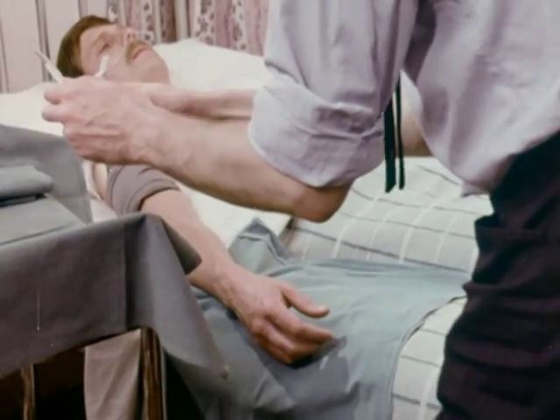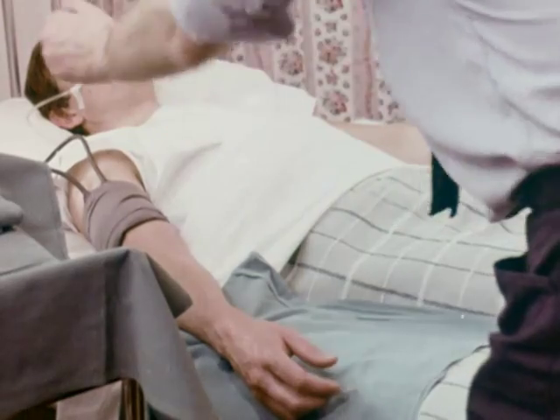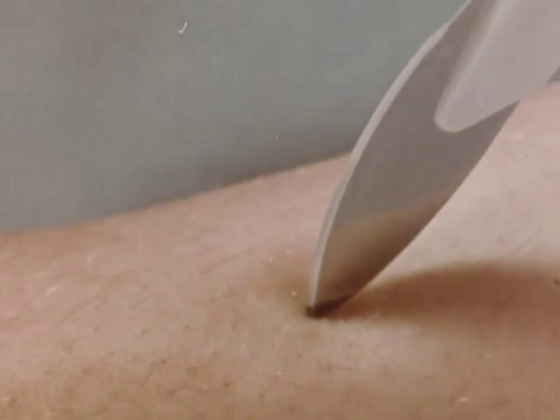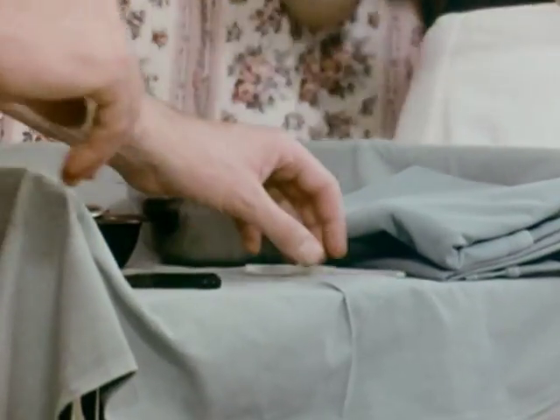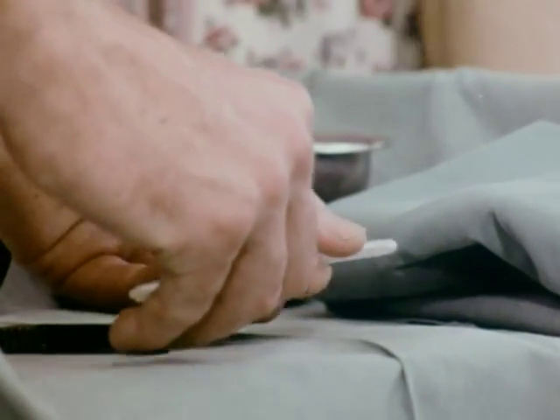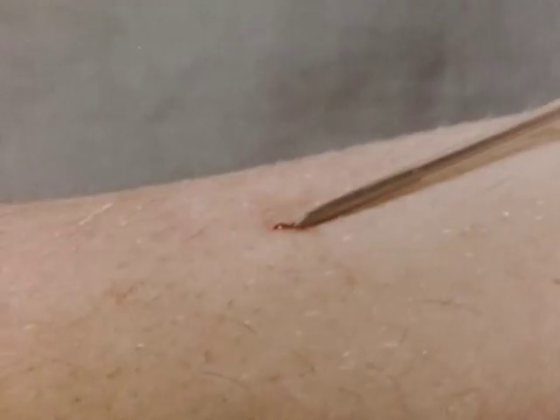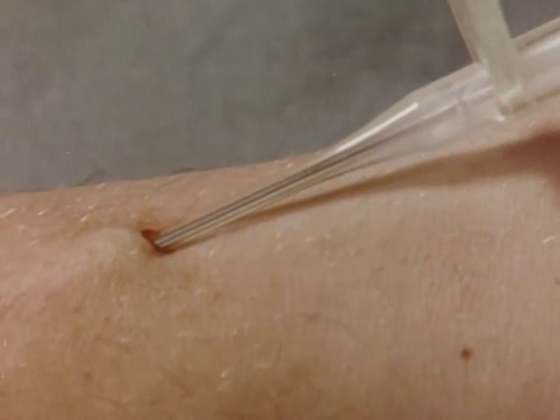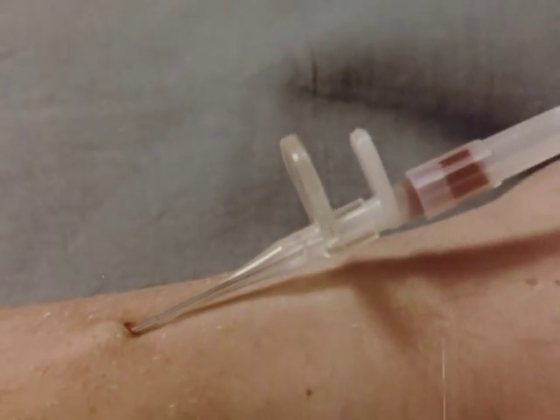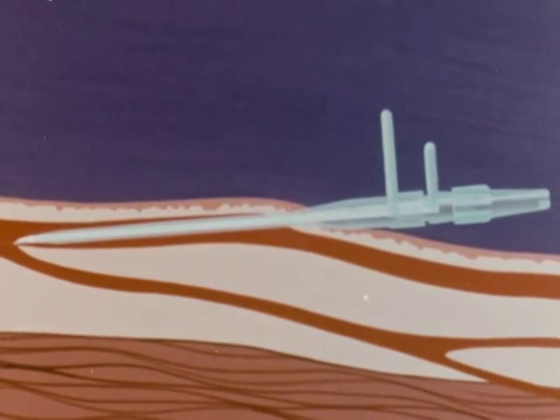Many doctors prefer to start the procedure by nicking the skin above the vein with a scalpel. This makes it easier and quicker to insert the cannula. The cannula is usually introduced through the skin directly above the vein and as parallel to the skin as possible. This is so that vein entry will not be at so steep an angle as to risk penetrating the far wall of the vein. Then the cannula is advanced as far into the vein as possible.